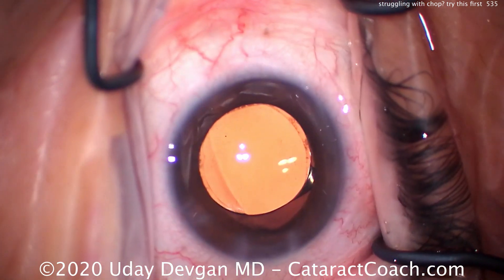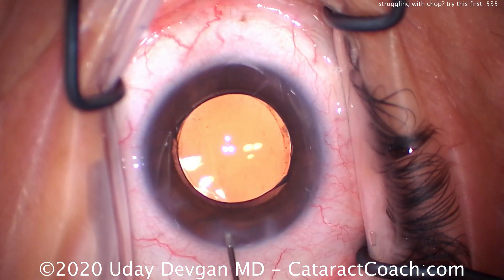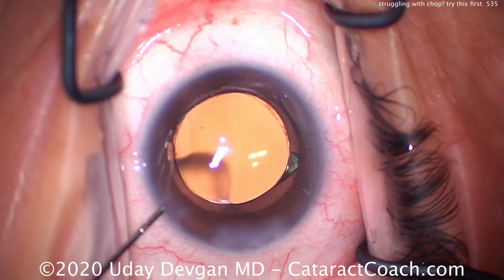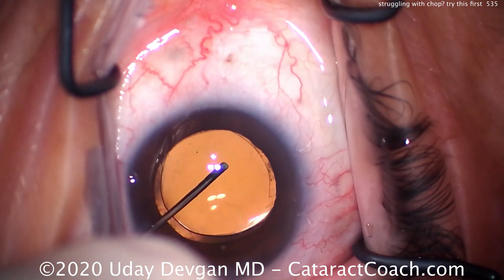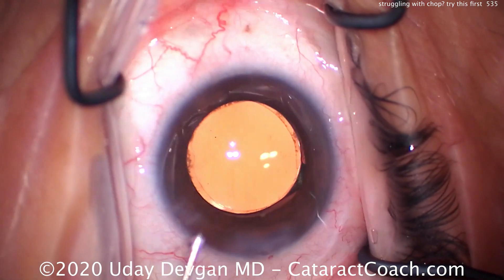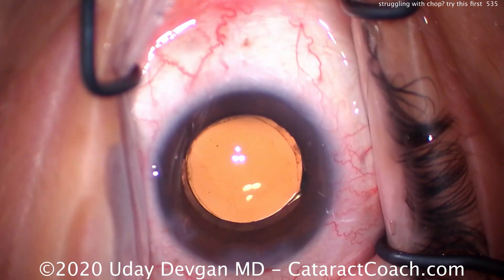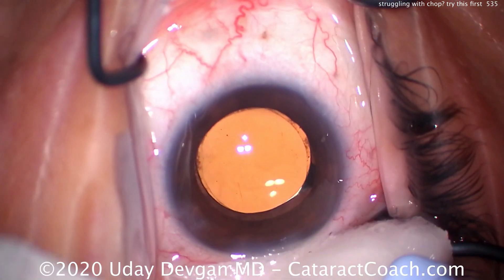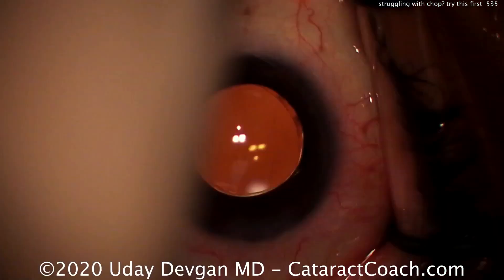I'll show you the end of the case for completeness. I like the draping on this case — it looks good, all the lashes are out of the way. Here's the sealing of the incision, back and forth just in the mid-stroma — just enough to get the incision to seal. Don't do those two big white dots on the side that people do when they're first learning how to seal incisions. Centering up the lens — there is a nice overlap of the optic by that rhexis. Then we check everything, check what the incision looks like. A little bit of tetracaine on a sponge, check with a dry sponge. Looks great.